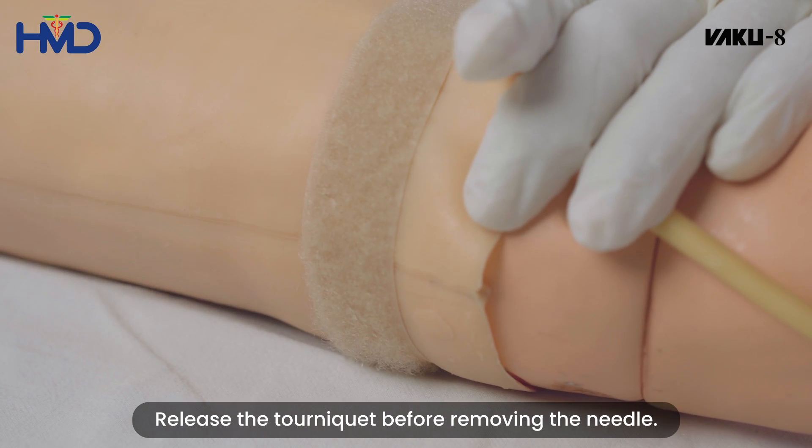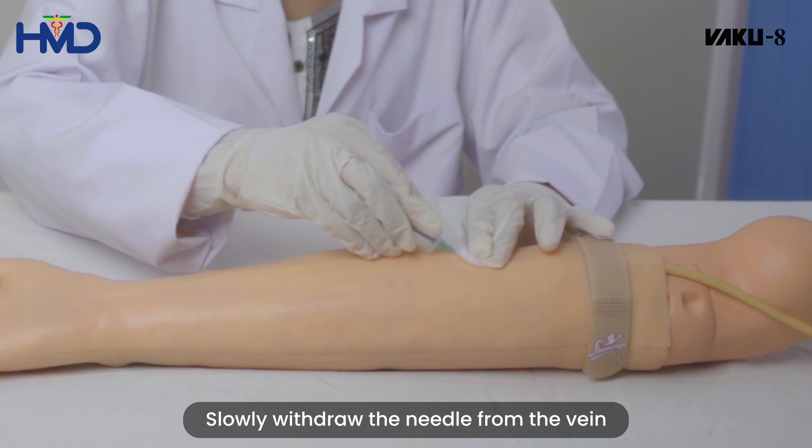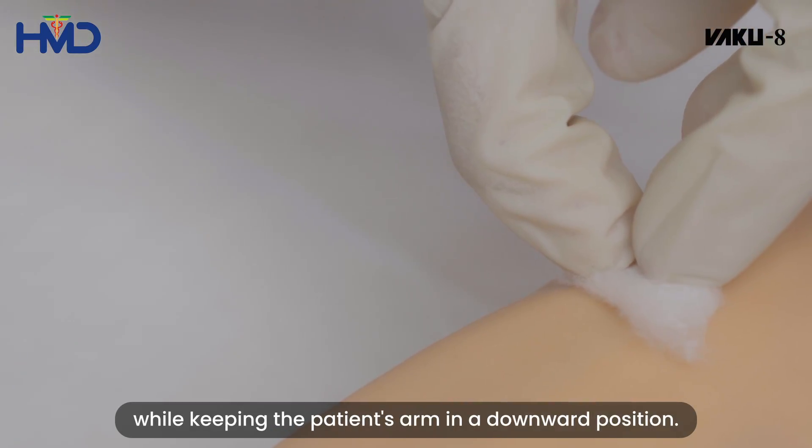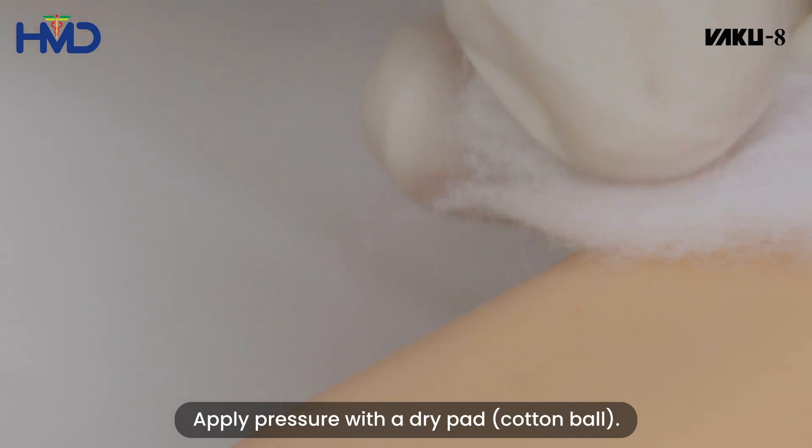Release the tourniquet before removing the needle. Slowly withdraw the needle from the vein while keeping the patient's arm in a downward position. Apply pressure with a dry pad.